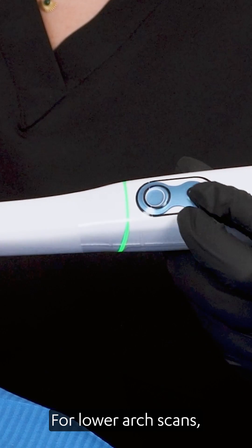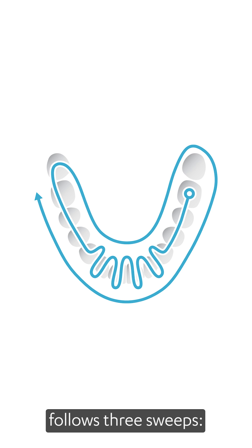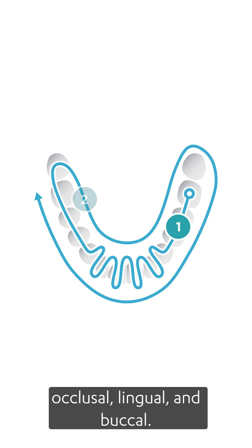For lower arch scans, keep the tip parallel to the occlusal surface. The recommended scan strategy follows three sweeps: occlusal, lingual, and buccal.